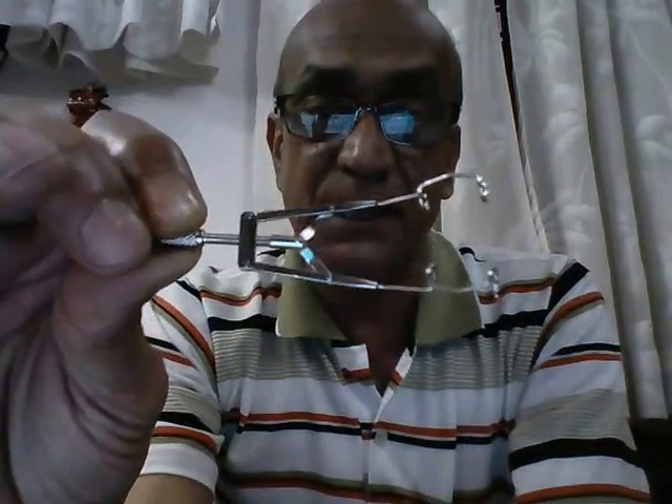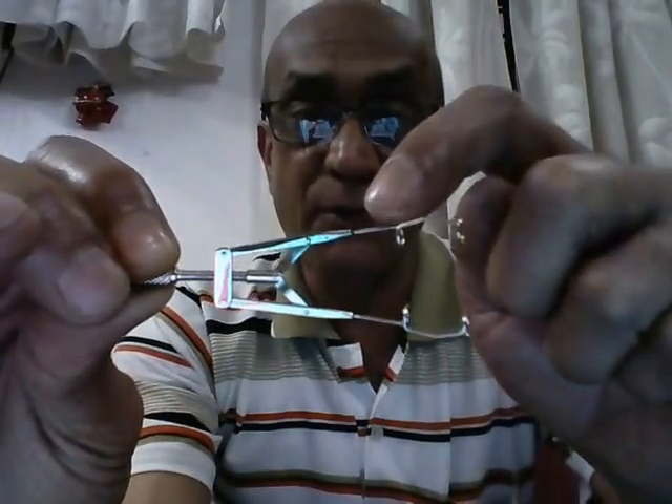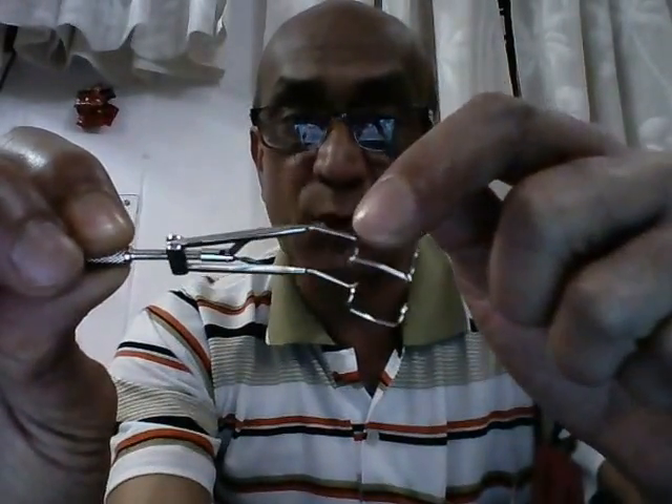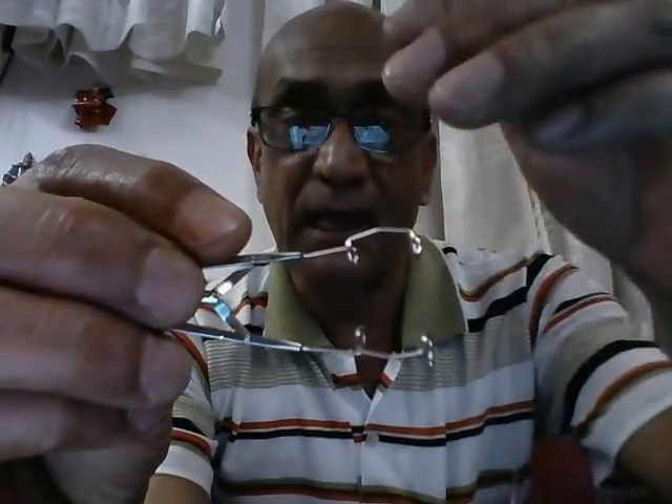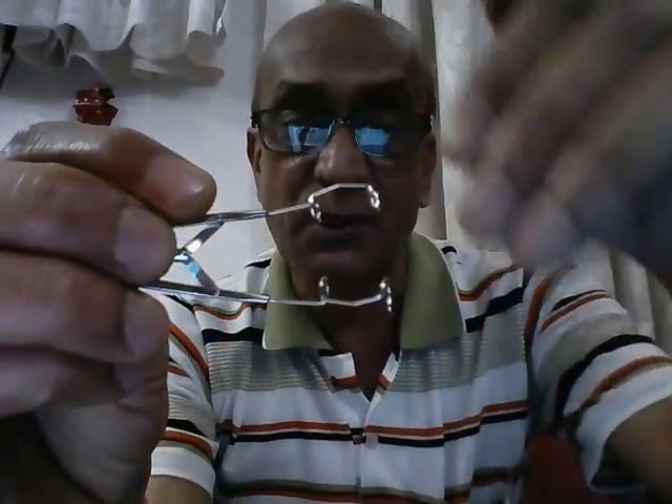So therefore, this is an adjustable eye speculum. However, this has one drawback. Once we have separated the two eyelids, this portion is unguarded. This means that the eyelashes can peep into the operating field when we are doing the surgery.